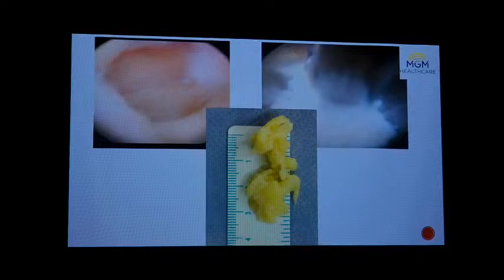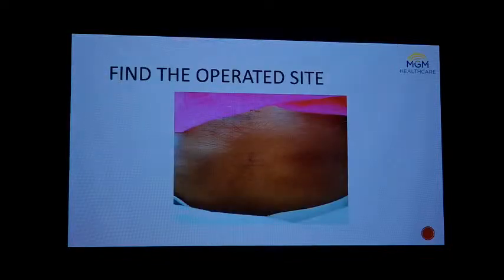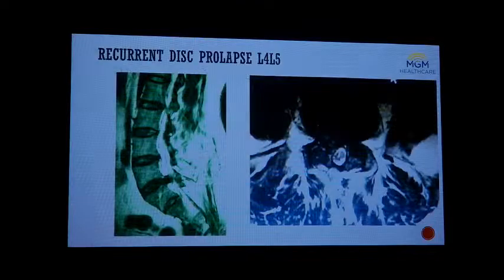And the large disc fragment comes out, and the next day when we change the dressing, you can barely see any wound there, and most of the time we don't use any sutures. It becomes very handy, particularly in revision surgeries.